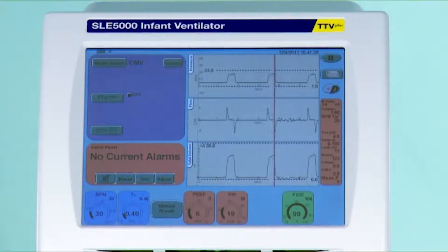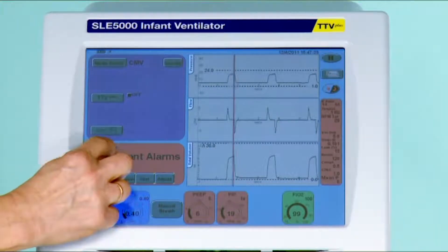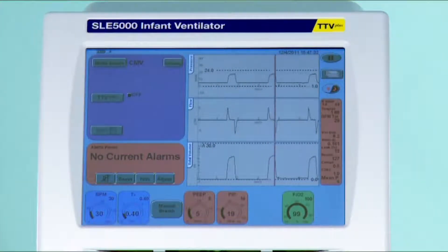Many of you may have seen an alarm which appears in the top of the alarm window saying reset contamination alarm. Probably many of you have not known what this alarm is or what to do about it. I'm going to show you how it happens and how to prevent it.